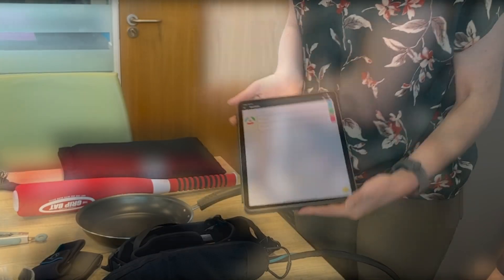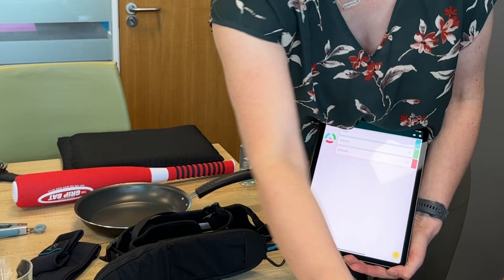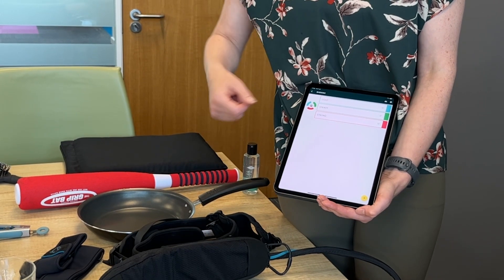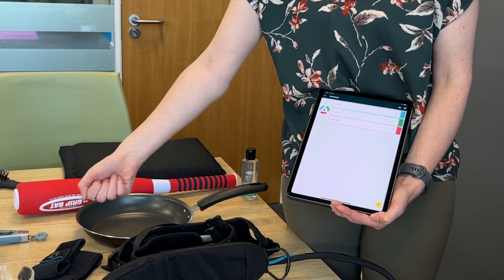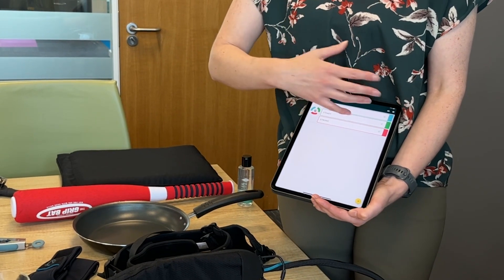The Carbon Hand can be set up with one hand and is ergonomically designed for use on the go, allowing its user to grasp back their sense of independence. It has three profiles indicated by colour on the glove. Different profiles suit different tasks — for example, you need a lot more assistance using a hammer than a feather duster, and someone may fatigue more as the day goes on.